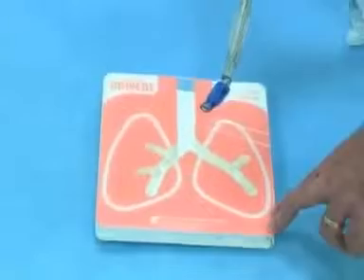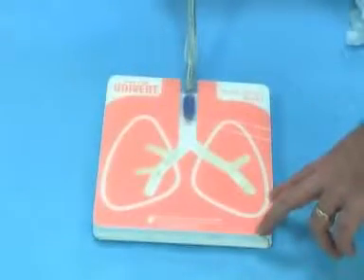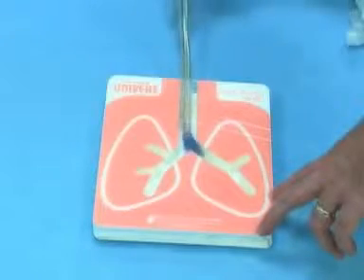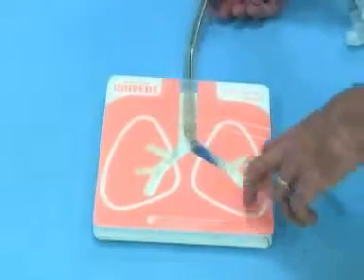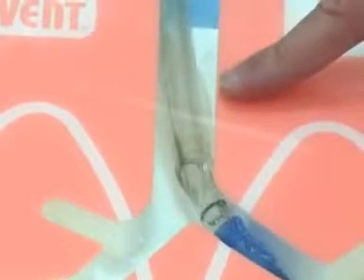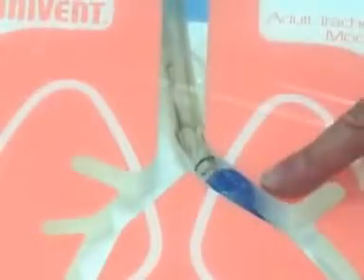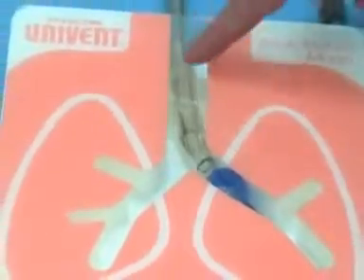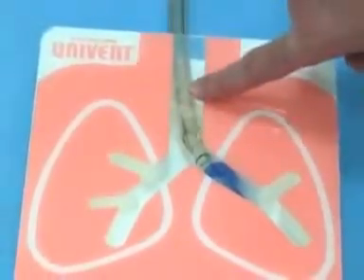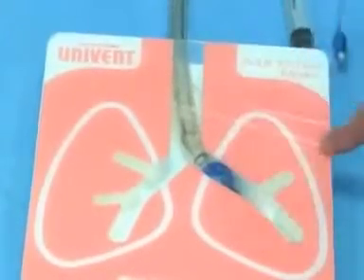Now let's put the double lumen tube in the correct way. The tube goes in, you turn to the left, you go until it stops, then you pull out your stylet, and now you're going to first inflate the tracheal cuff to create a seal, and then inflate the bronchial cuff. We have a left-sided tube with this portion in the trachea and this portion in the left main stem bronchus.